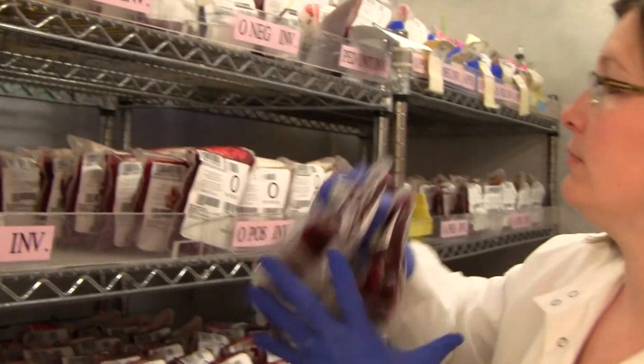We are both part of our senior design team. Our name is Hemobox and we are designing a blood storage and transportation cooler. We use coolers to transport blood throughout the hospital, mostly to the O.R., and then up to the patient's floor once they're done with their surgery.